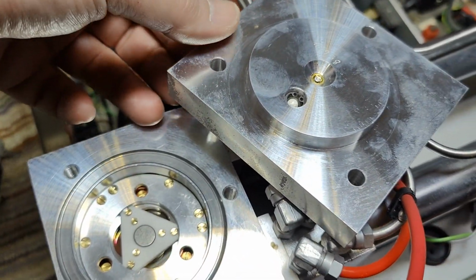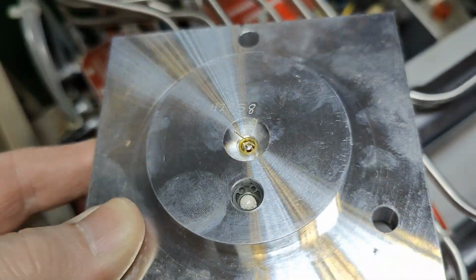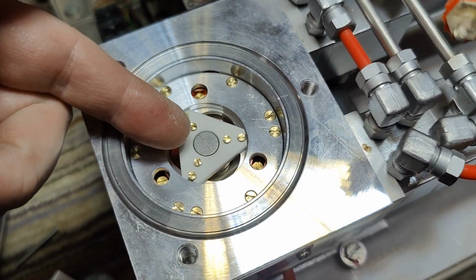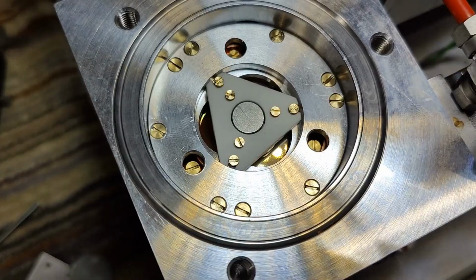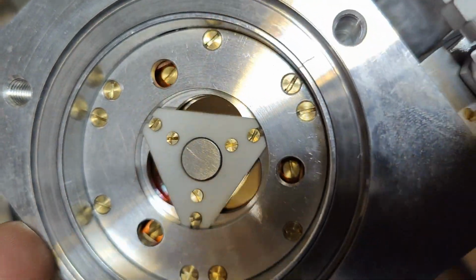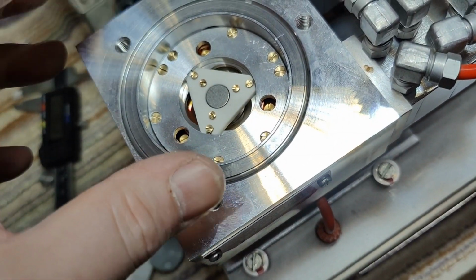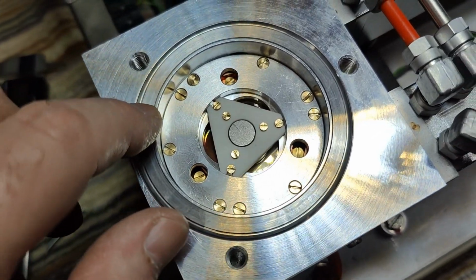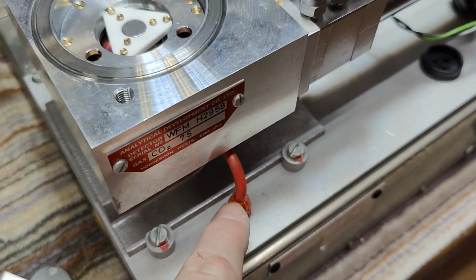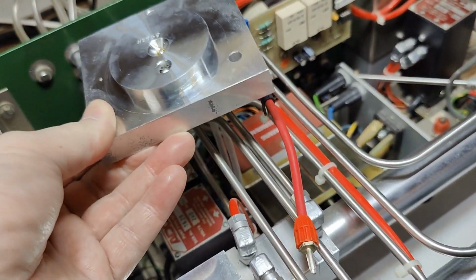And then I find this quite interesting. So here at the top there's a tiny little contact, right? And this contact goes down to that little piece down here. So here is the sensor, and we got some different colors of some kind of sensor materials here. So I bet something rotates in here as well, and this way it sees different wavelengths or some stuff. Can't wait to pull this apart. And there's probably another one here at the bottom, identical to that one. Funny connector, huh?